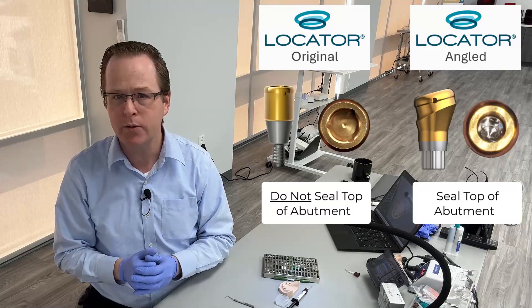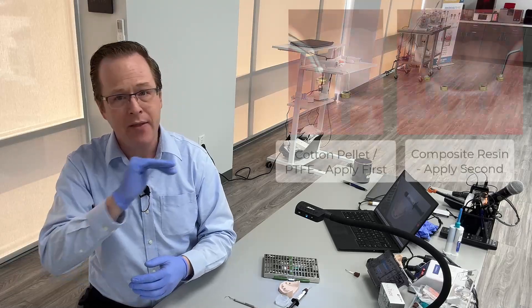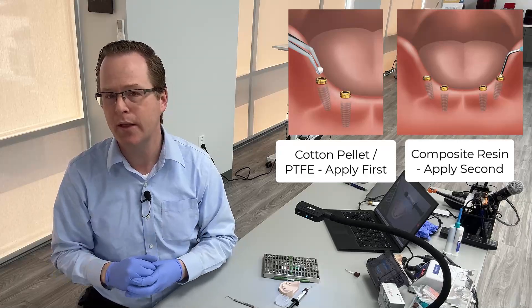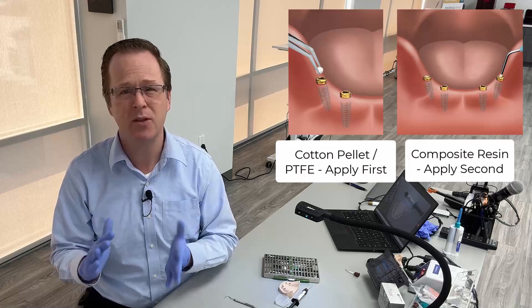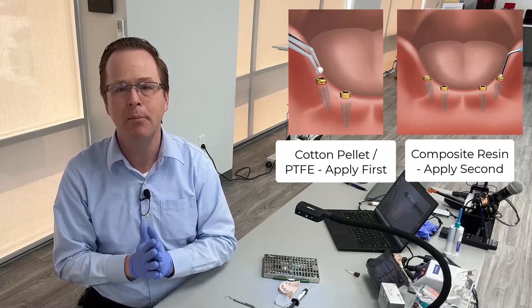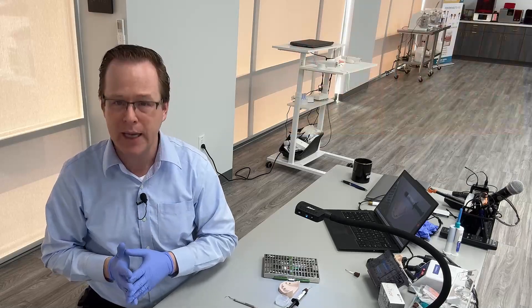What we're going to do is seal and protect the little retaining screw with a PTFE or a cotton pellet, and then seal with a composite resin over the top, so that way it keeps everything nice, hygienic, and sealed on the inside of the abutment — very similar to what you would do for your traditional custom abutment or implant-retained crowns. That strategy we will apply to locator angled.